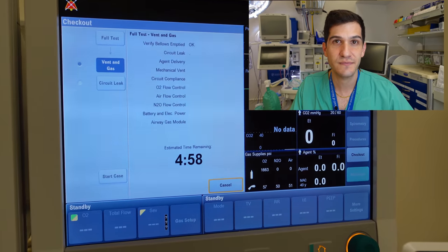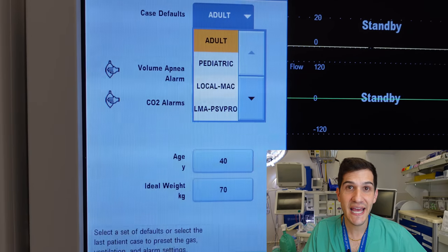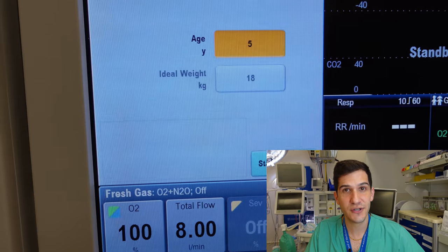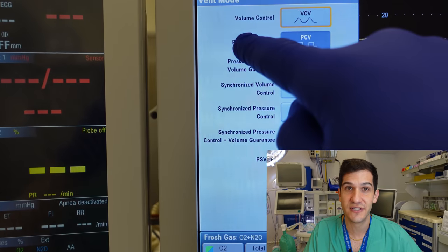So I'll go ahead and do a full machine check here. The last part of my machine setup is dialing in the patient's age to my ventilator and making sure I've got the ventilator set to the mode I'd like when I get the case started, which in this case is going to be pressure control ventilation — very commonly used for pediatric cases.